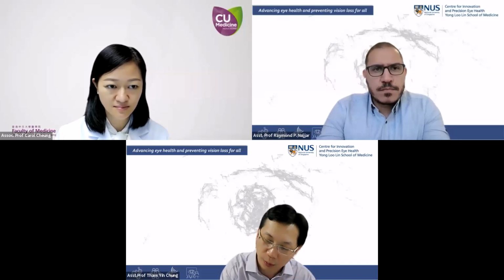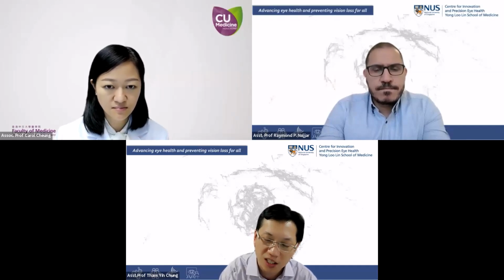Versus an optometry practice, and I totally understand where this question comes from. Let's say the retina AI report comes up and flags something very suspicious. Should the optometrist refer directly to the neurologist? You go straight up to the tertiary level, but is that overly sensitive? Are we causing a lot more false positives? Are we over-alarming the patients as well? These are genuine concerns, which is why I think the criteria and how to refer really depend on the setting as well. Raymond, did you have any thoughts on this?